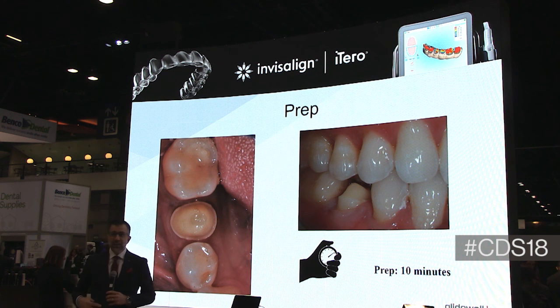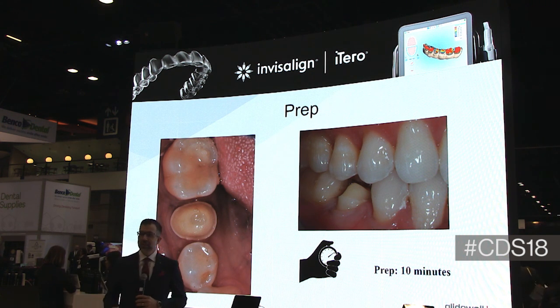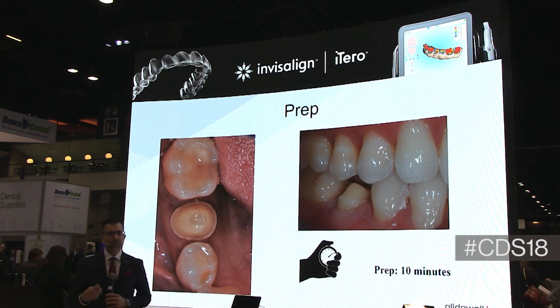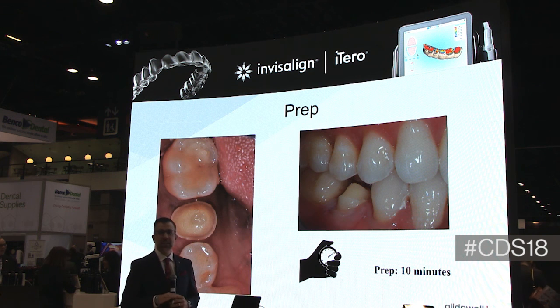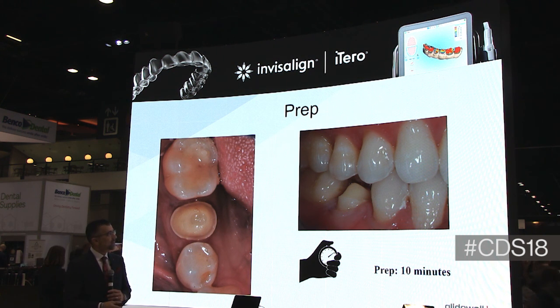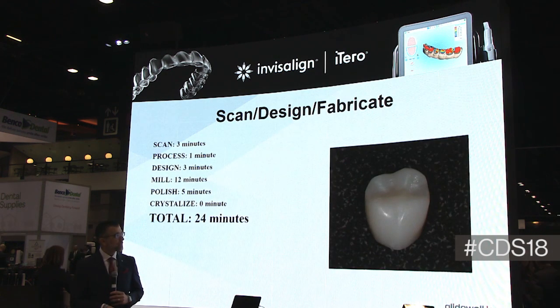So it's a young male. I didn't want to do a subgingival crown preparation, and I didn't need to do a subgingival crown preparation. I wanted a full coverage restoration that would cover as much of that tooth as needed. Not too much, not too little. So we did a full coverage restoration. We left the marginal edge a little bit above the gingiva on the facial aspect.